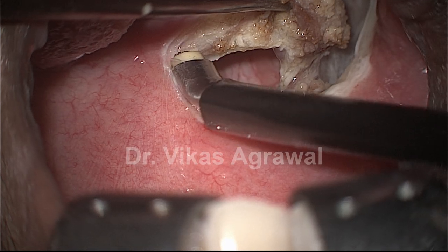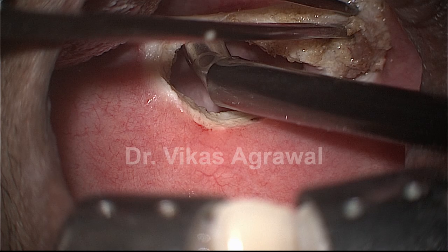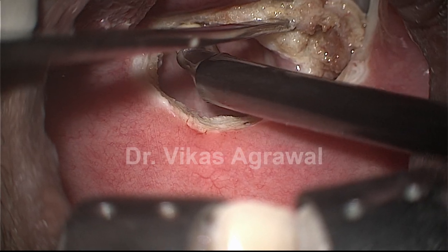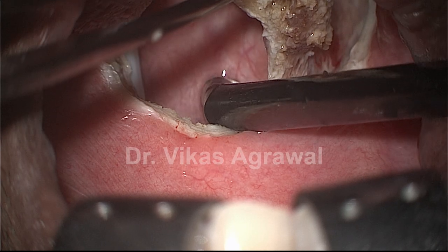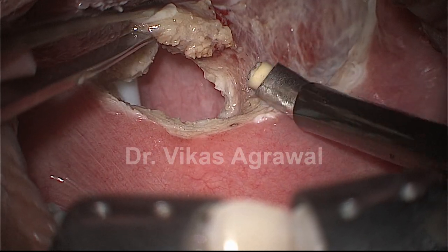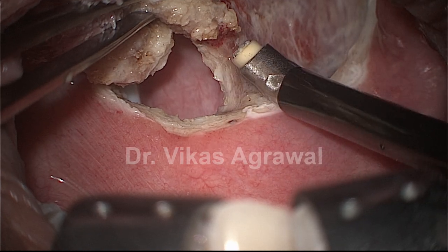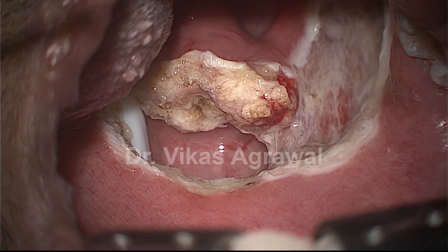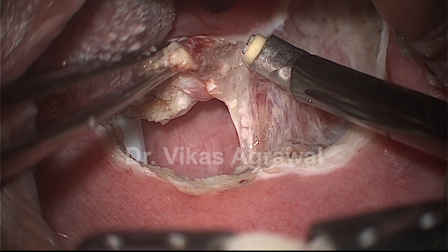At this point of time let me remove this part of the soft palate along with the uvula. So that is the length of the soft palate still remaining to prevent velopharyngeal insufficiency. This is the posterior pillar — the palatopharyngeus — which I am going to take laterally, but before that let me remove the uvula at this point of time. These are the fibers of the palatopharyngeus.